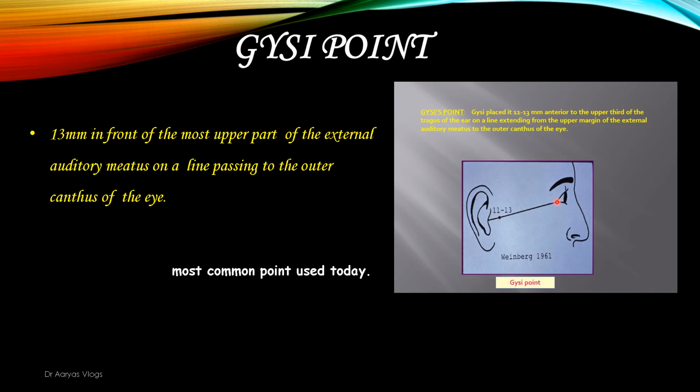Here it is the outer canthus of the eye. And this is the most common point used today.